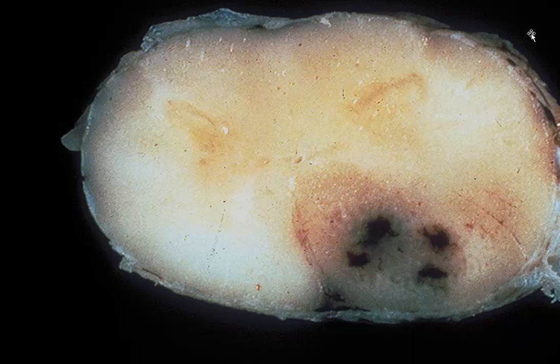And then there are a couple of others that can hit both, and the one that I like and I would include in this would be Sarcocystis neurona. You can see necrotizing lesions both in the white matter and the gray matter. Sort of a rarity might be a verminous myelitis like you might see with Parelaphostrongylus, which is just going to go wandering wherever it wants. But I certainly asked you for 2. I think the best 2 for this one would be equine herpes virus type 1 and Sarcocystis neurona, the causative agent of equine protozoal myelitis.